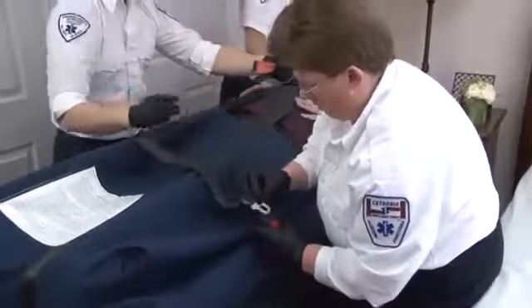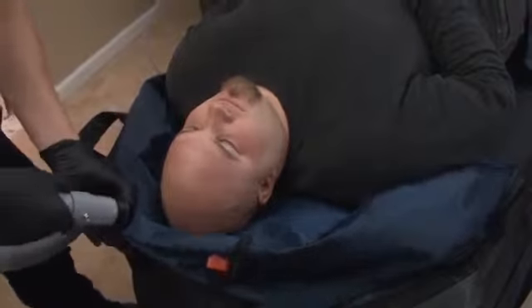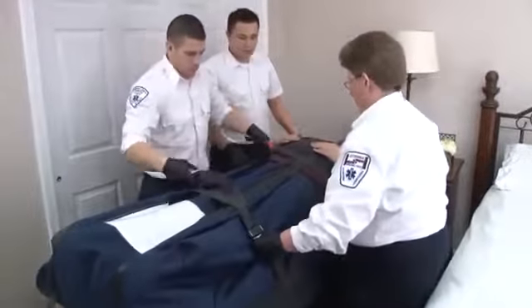Zip the foot pouch over the patient's feet and lower legs. Buckle the Evacuation HoverJack 2 safety straps and body harness loosely over the patient. Bring the air supply to the back of the device and inflate the head pillow if desired, using the same inflation technique demonstrated with chambers 1 through 4. After the pillow is inflated, adjust the safety straps until taut.